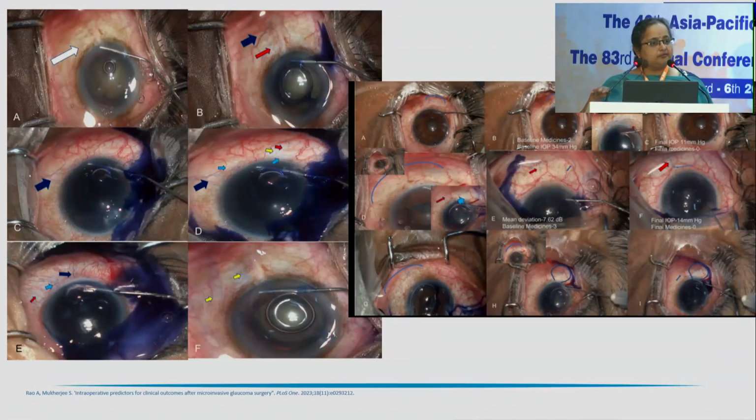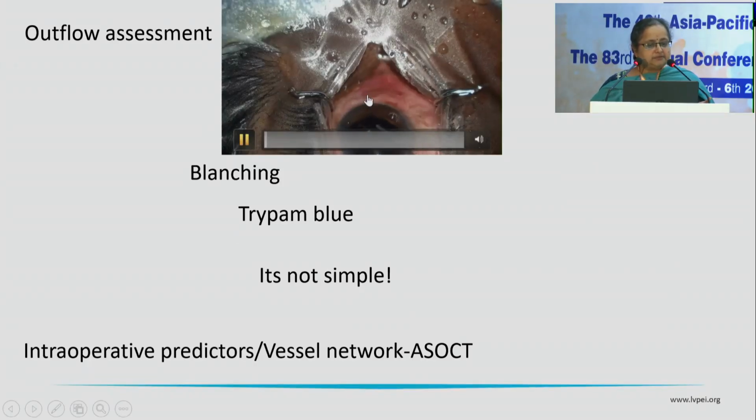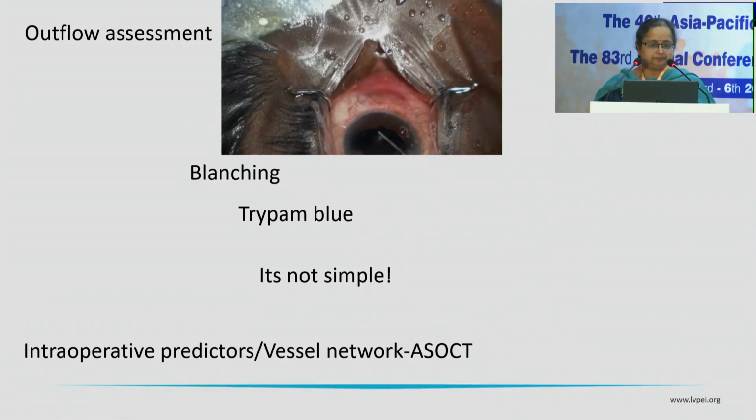You don't have any superficial vein, which is very difficult to think of. Then how are the deep veins draining to the systemic circulation? We don't know. And the other type is a reticular pattern, which means a spider web kind of small vessels at the limbus, but no vein lighting up further. So you really don't know whether those few vessels at the limbus are draining such a large area. We don't know. Some people might have seen these videos of what I refer to as blanching, you can see here.